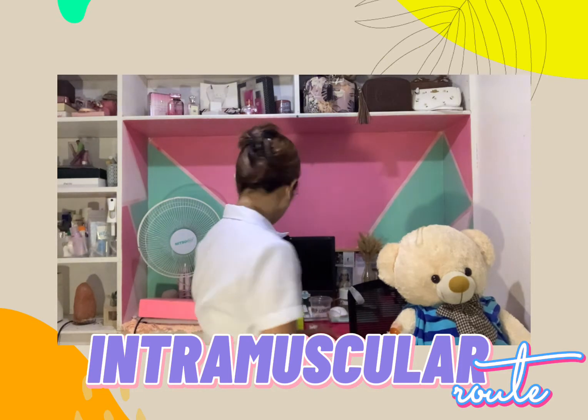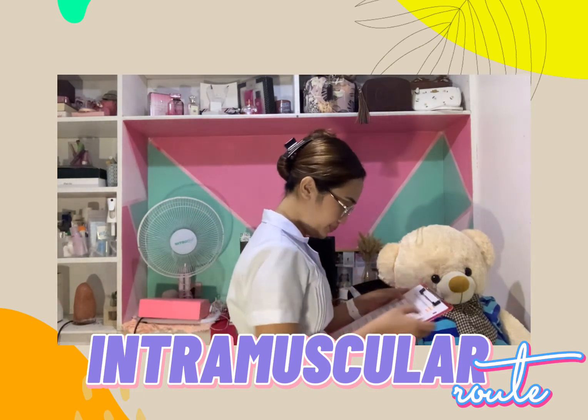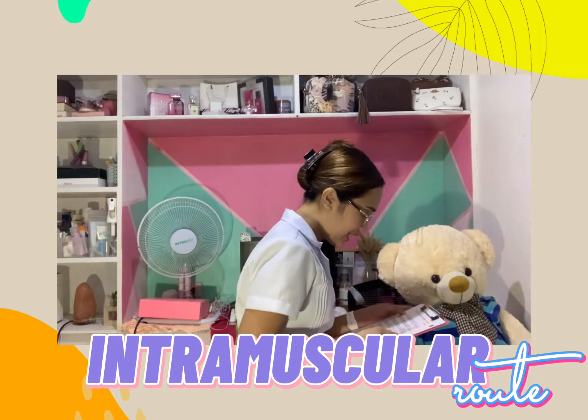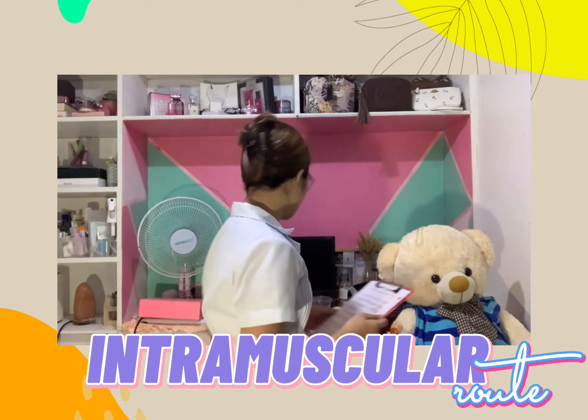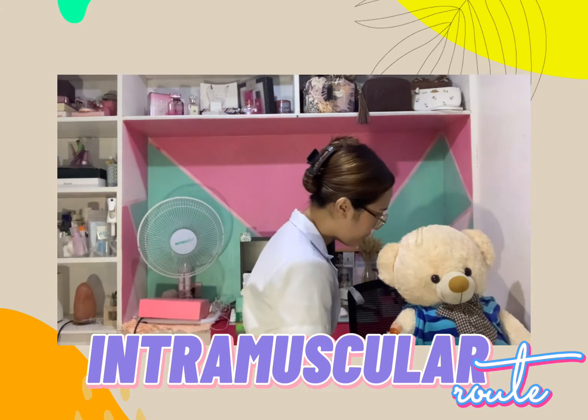Good day ma'am. May I clarify, do you know your weight? Okay. May I know your birthday? Okay. At that age and weight, we can administer the medication on your deltoid area. Is that okay with you, ma'am?